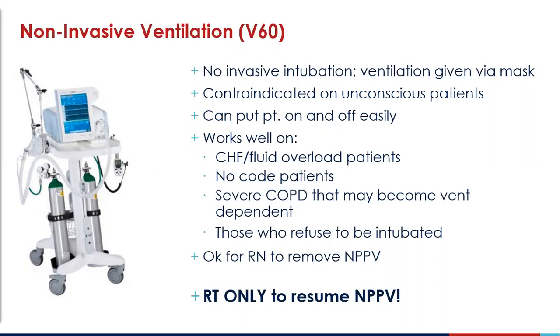It's okay for the RN to remove the non-invasive ventilation. It will switch to standby when removed. Respiratory therapy only should be the ones to resume the non-invasive ventilation.